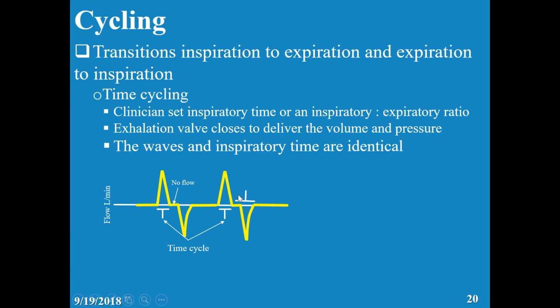And when it's time, it's usually fixed time. And the good time is when you see there is a pause before and a pause below, after, normal CO2, good oxygenation, and the patient is not fighting. That is a very good inspiratory time. So remember, the flow has to go back to zero and start from zero.